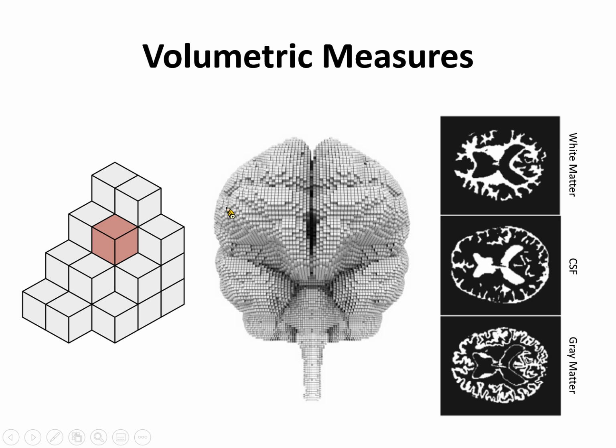So we can divide the brain into millions of small voxels. Then for each image, we can divide the brain into different areas, and we can sum up the gray matter volumes in these areas to get some quantitative results. So we will use these volumetric measures to do today's work.